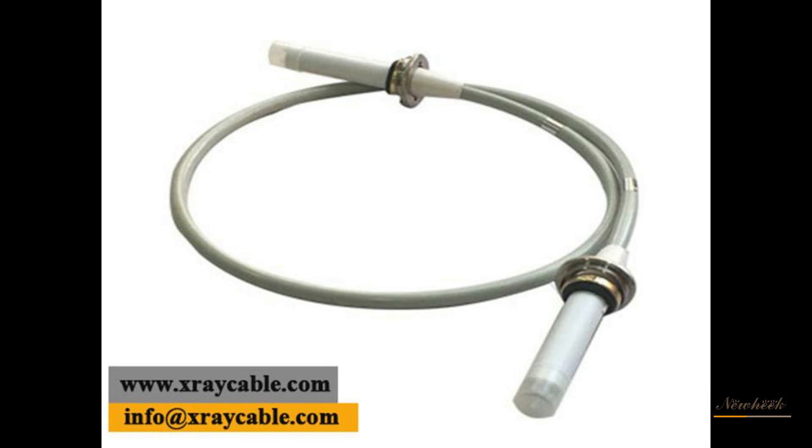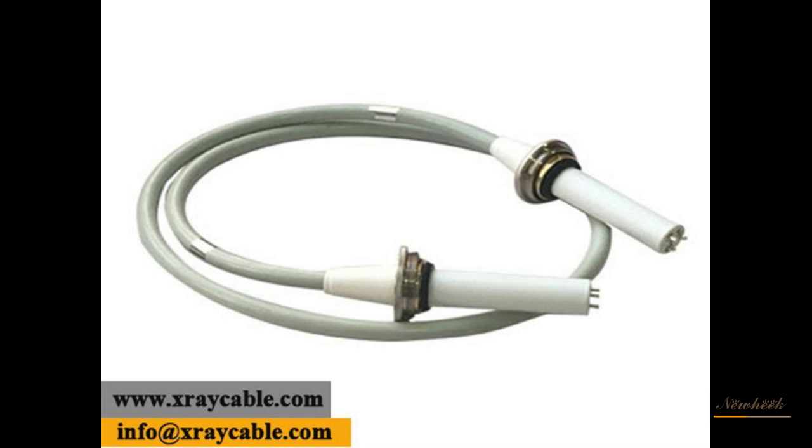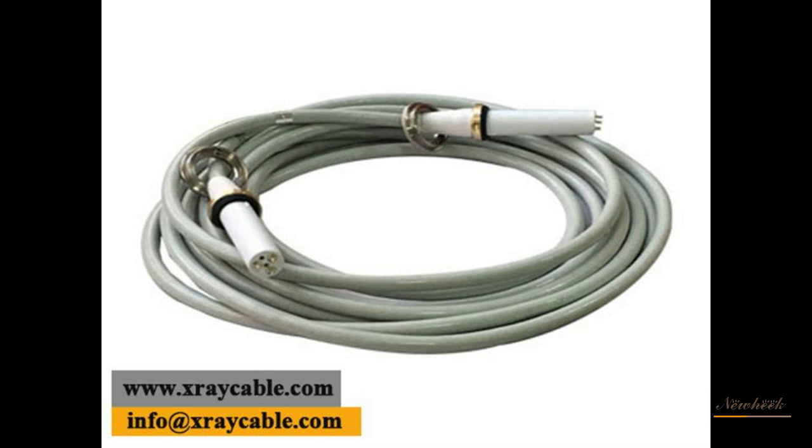X-ray machine high-voltage cables are divided into coaxial and non-coaxial types. Their structure from inside to outside consists of a conducting core wire, a high-voltage insulation layer, and a semiconductor layer.